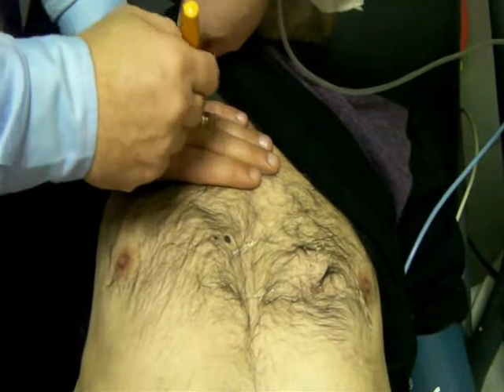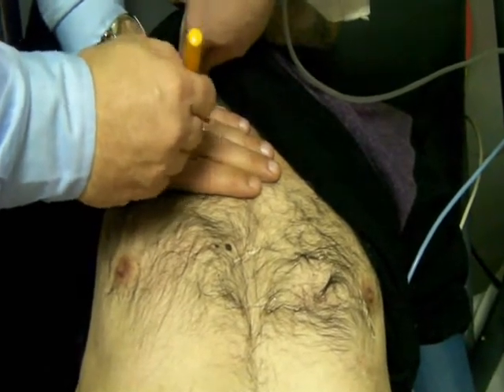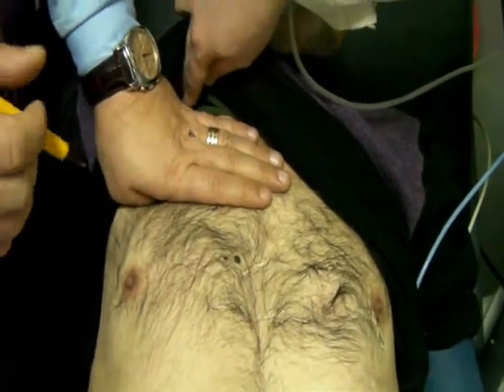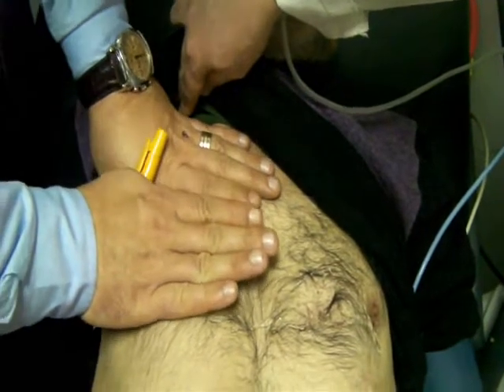We have four standardized bedside lung ultrasound points for each hemithorax. These are called blue points.